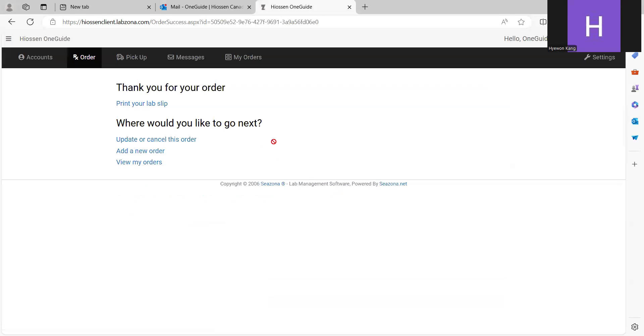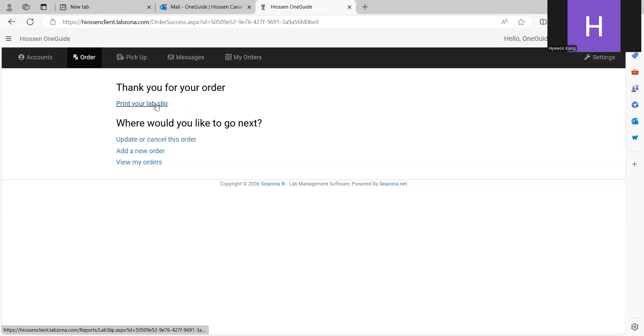Yep. We place the order. And then, if you want to send the impression to our office, you can print your lab slip here.